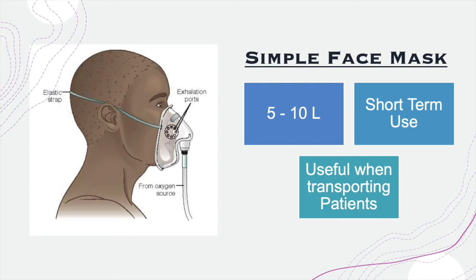So we're transporting a patient from the unit to maybe go to CAT scan or X-ray or to a different unit, and we want to maintain their oxygenation. We can slap on a simple face mask, transport them through the hallway, and that will benefit them very well.